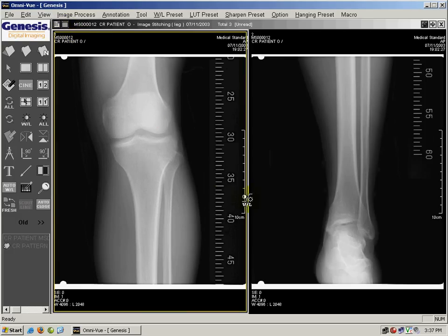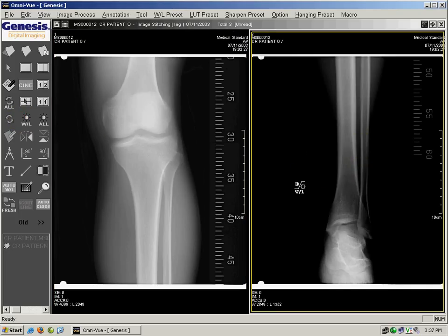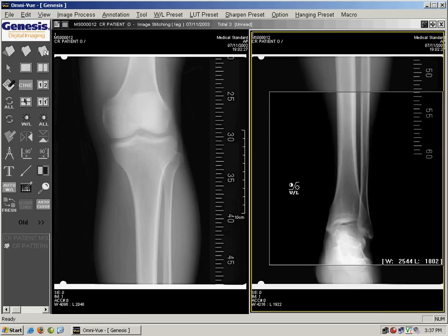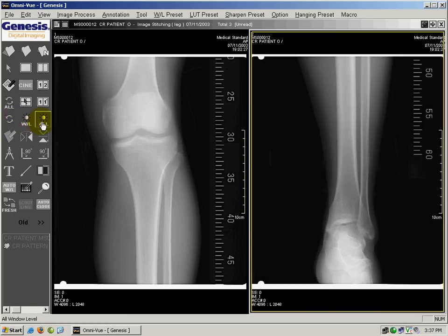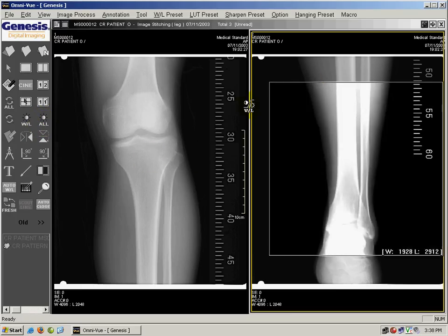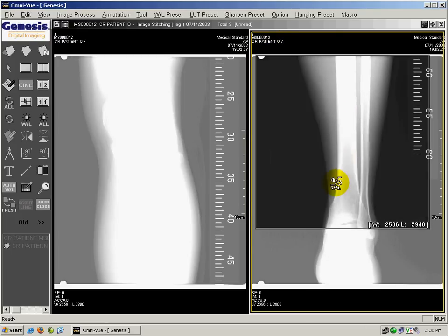If you have two images open, you can window level a single image by left clicking on it. Or you can window level all images in a series by clicking on the window level all button, then left click and drag, and it will apply all of those changes to all the images in the series.